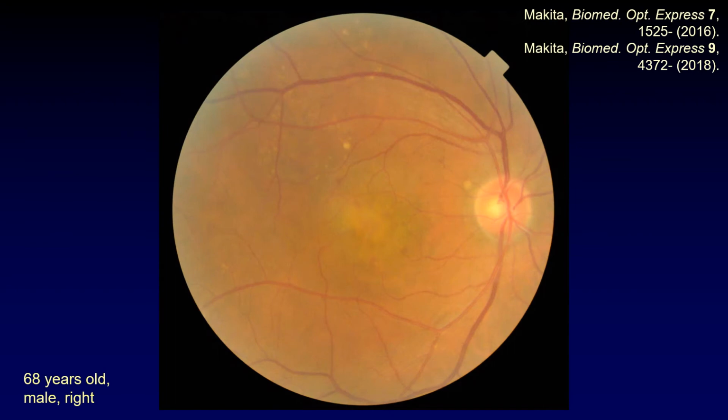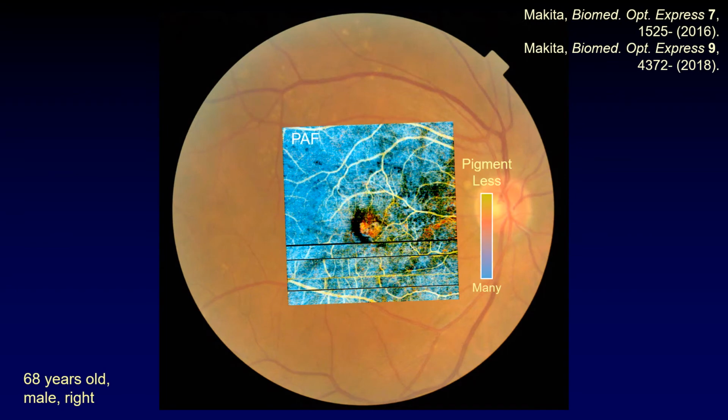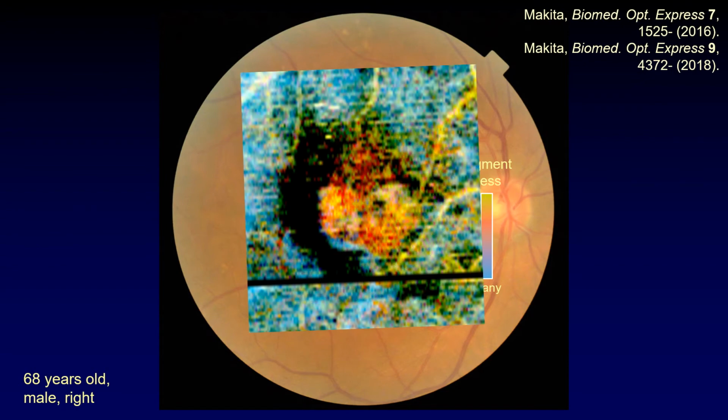In this case, we can see a clear abnormal blood vessel at the center of the retina. We surely can say that it is abnormal because of its shape, but at the same time, its color appearance is also abnormal. It appeared with orange color, which means that on top of this CNV, the pigment has already gone. In addition, by zooming in, we see a small blue appearance here. This means there is a residual of retinal pigment epithelium at this point.